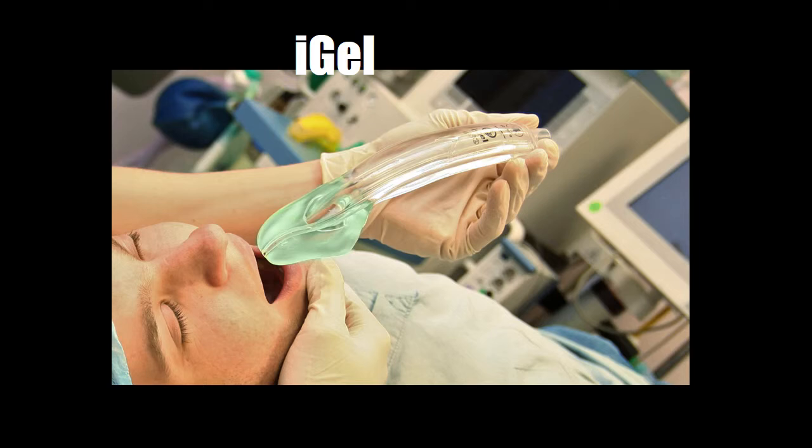So to go back to your point, Andy, you can either use a mucosal atomizer device, a MAD, or you can use an easy spray or an easy atomizer, one or the other. Adri, one of the anaesthetists here, has managed to get hold of the easy spray from the States. It's not currently available in Australia, but he can get it for his practice upstairs. I get on with him very well. It would be very easy.